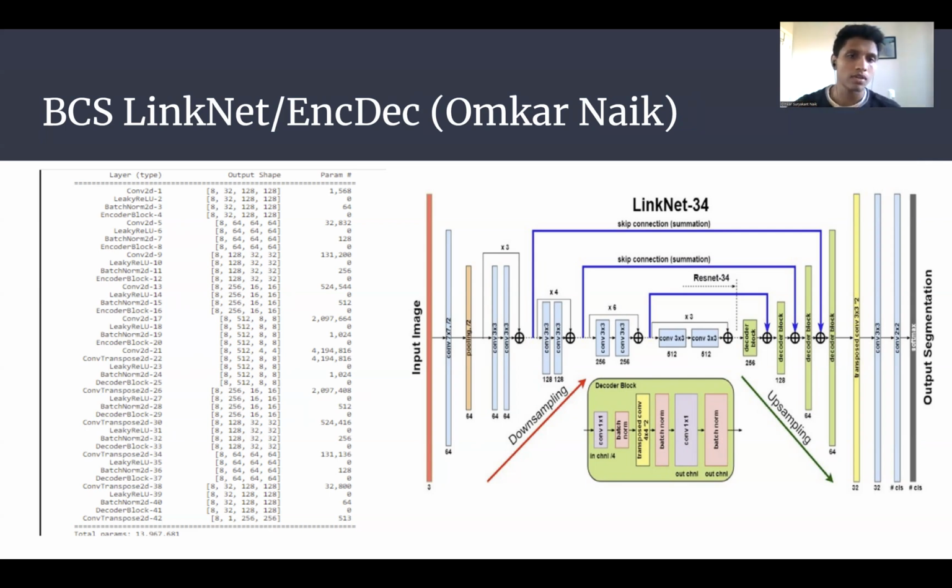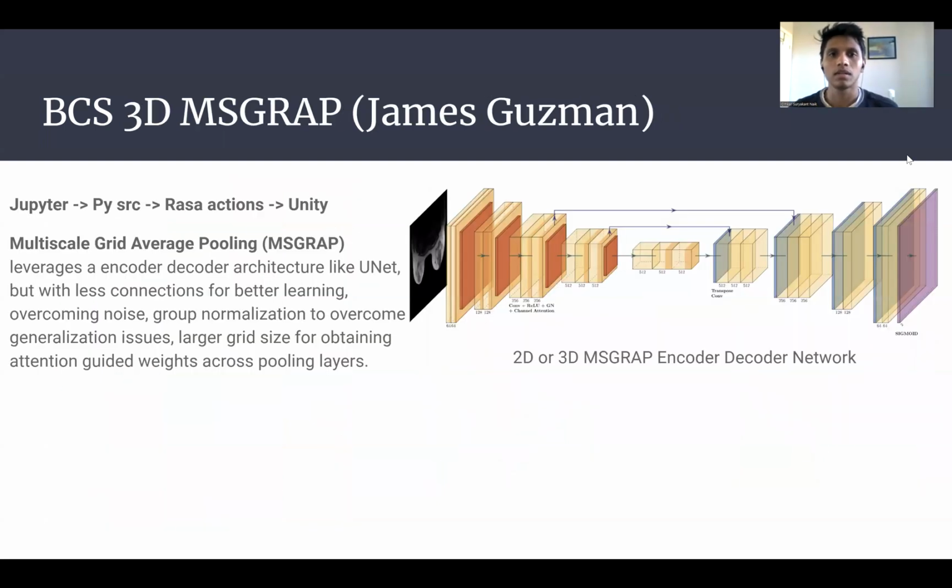And also here in the architecture, you might notice that I've used some extra layers of encoding and decoding compared to the original LinkNet model. I've also used the library-based approach where I was not getting that accurate result, so I had to make some changes into it, and I added few more extra layers of encoder and decoder. Yeah, next slide.